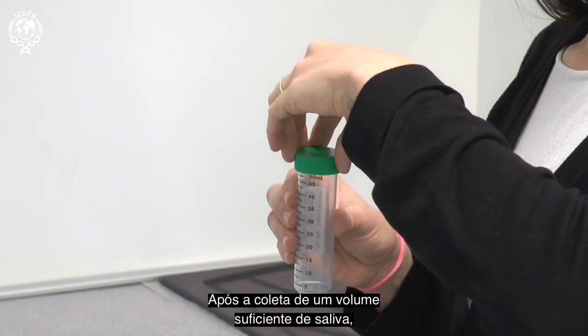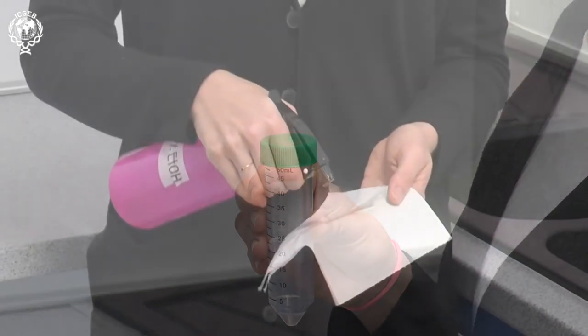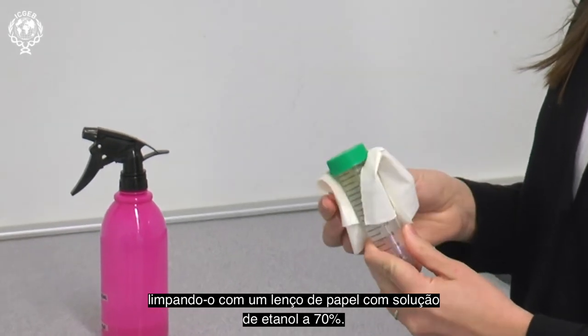After a sufficient volume of saliva has been collected, you should then close the tube with the cap, and proceed to remove any saliva from the outside of the tube, by wiping it down with a tissue wetted with 70% ethanol solution.